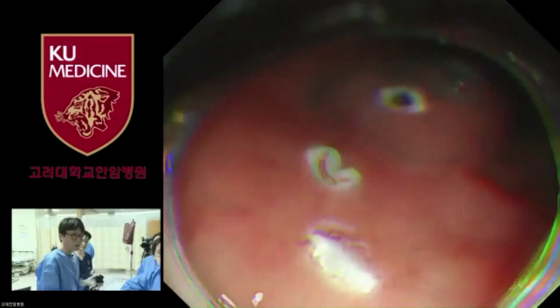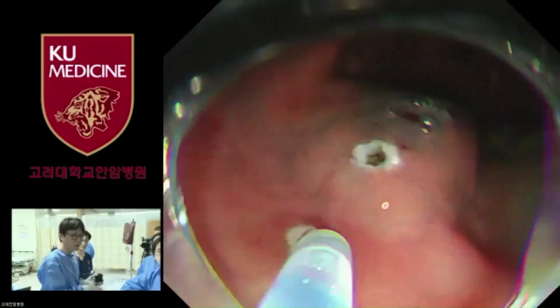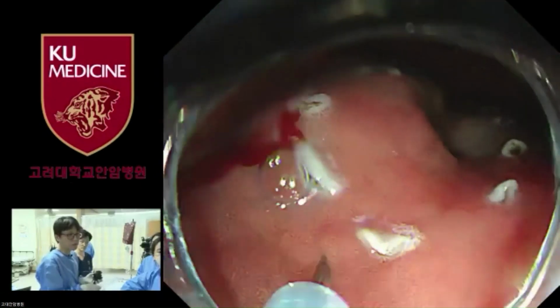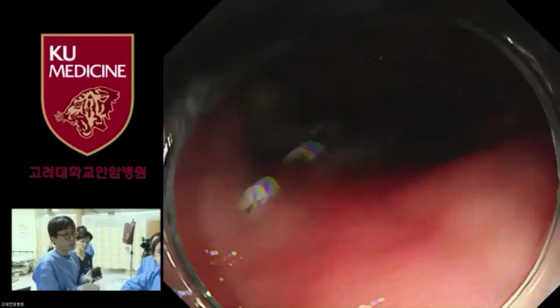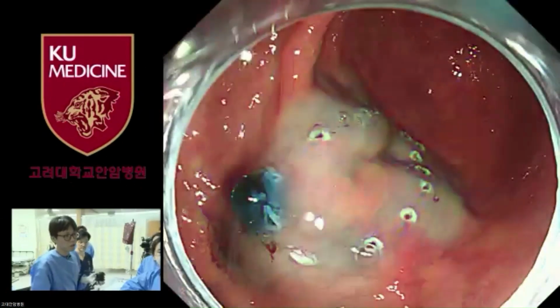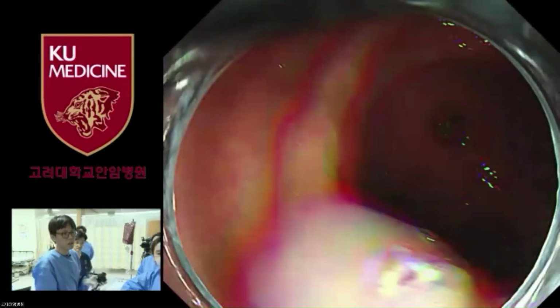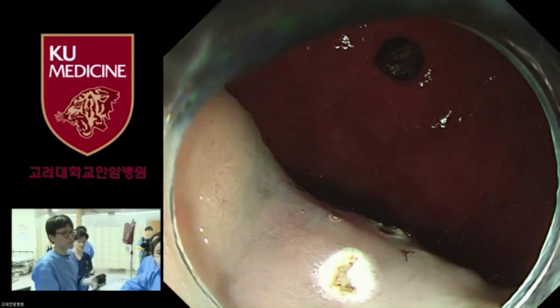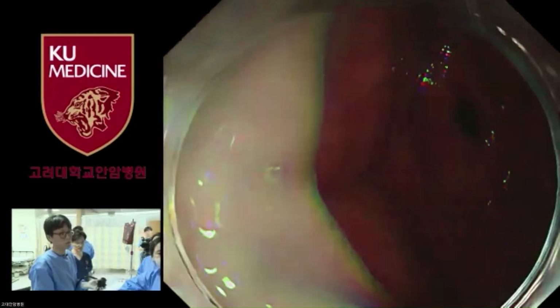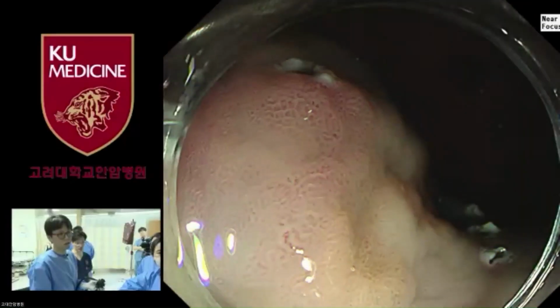Is that the usual procedure for every location of the stomach? No, in the case of the upper body, I use 100% hyaluronic acid because it depends on the submucosal fluid cushion lasting time. Usually, for a lesion located on the antrum side or lower body side, the normal saline only solution would be enough to maintain the submucosal cushion while doing ESD.